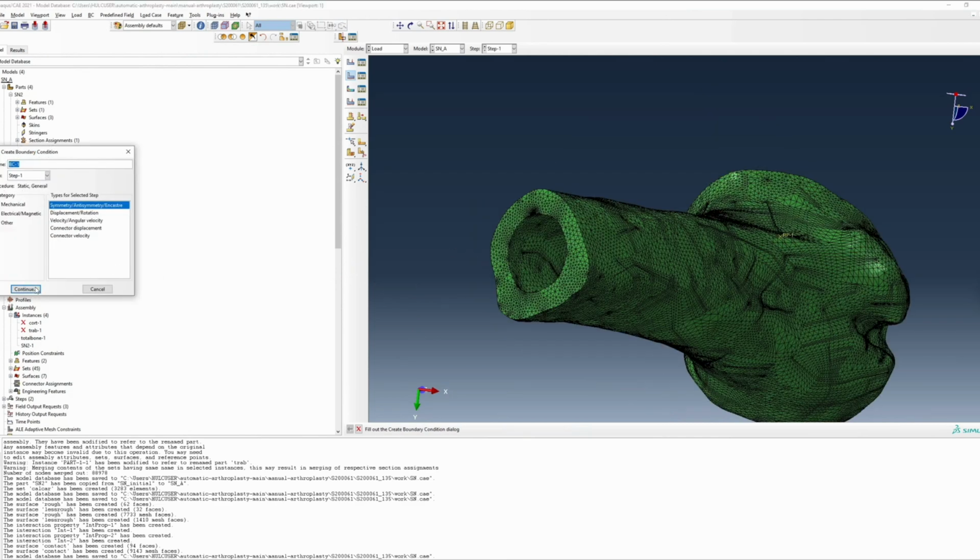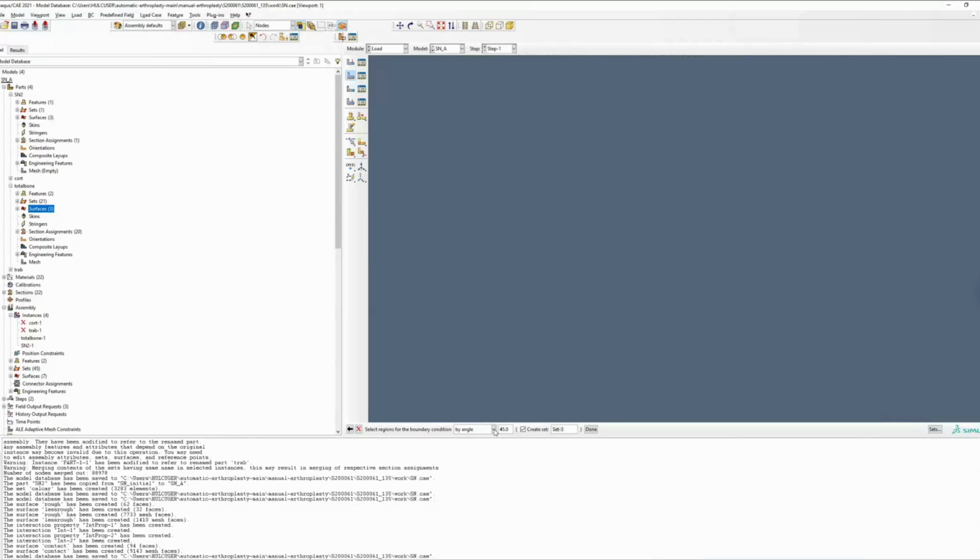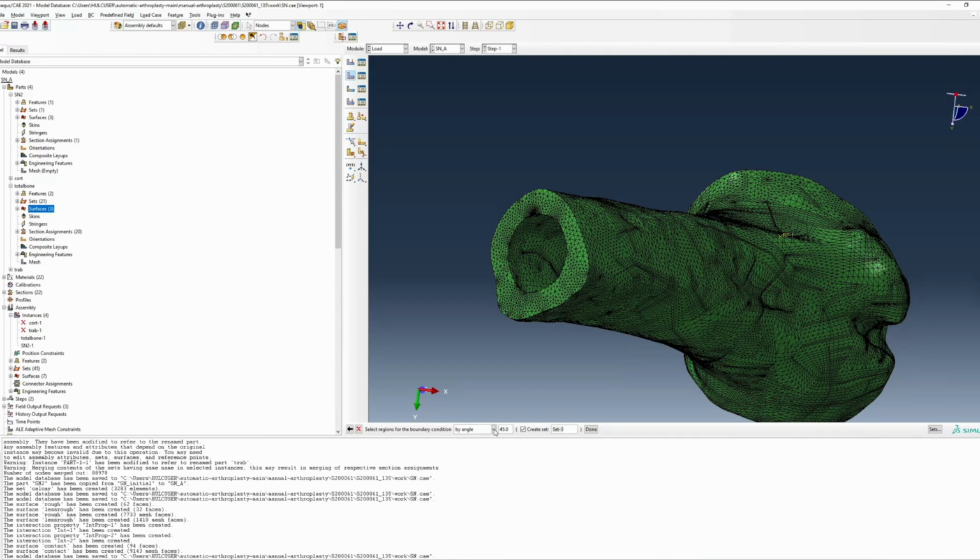For my boundary conditions, I am applying Encastre boundary conditions to the distal resection surface of my cortical humerus. This, again, should be unique to your own analysis, and there should be some sort of data indicating what boundary condition is considered far field from your areas of interest, and will therefore not affect your primary outcomes.